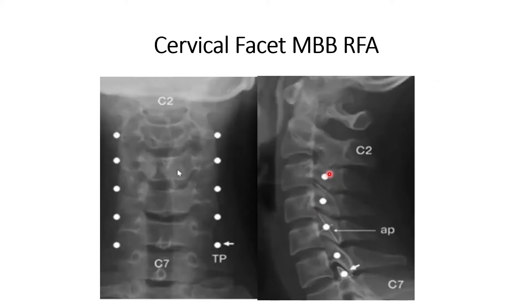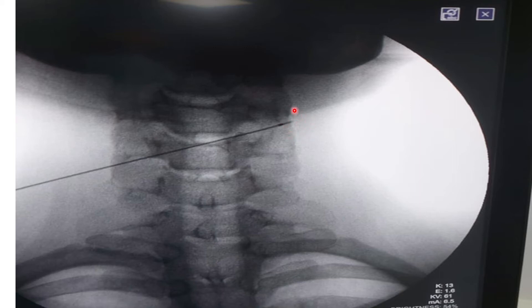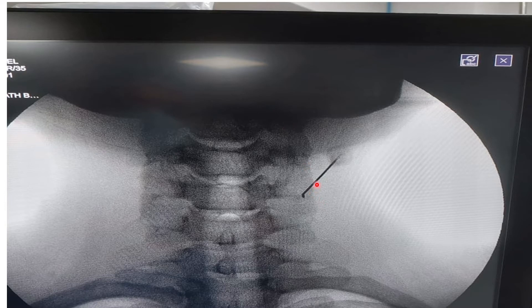While giving a diagnostic block, the lateral or supine position is okay. But for radiofrequency ablation, the prone position is mandatory, as the needle enters from behind and has to be parallel to the medial branch. So with the patient in prone position, local anesthesia is given. This is the RF cannula — after giving local anesthesia I will be entering here in tunnel vision.